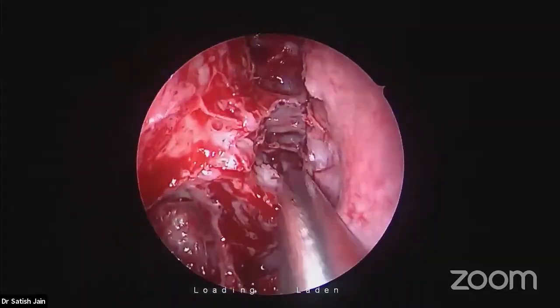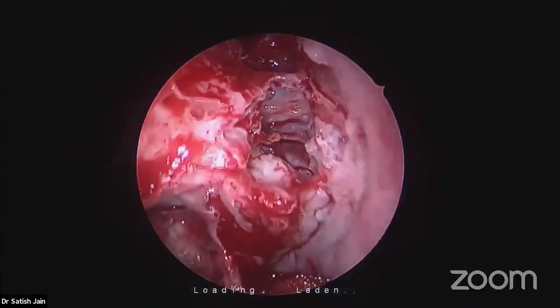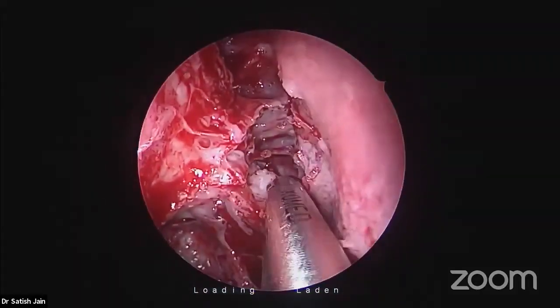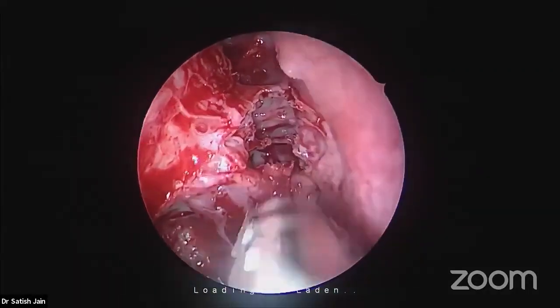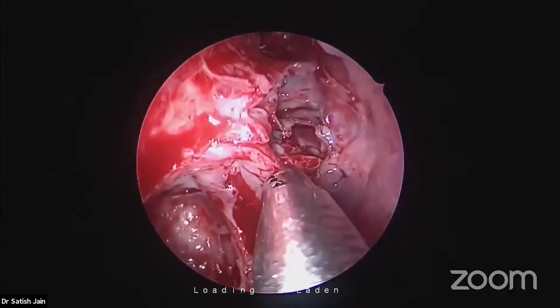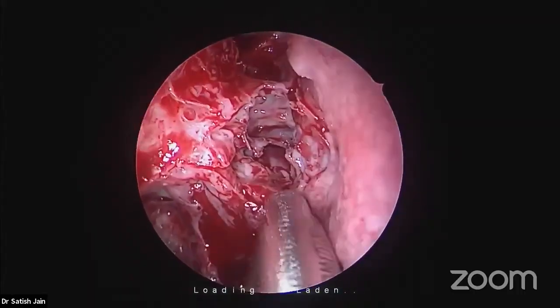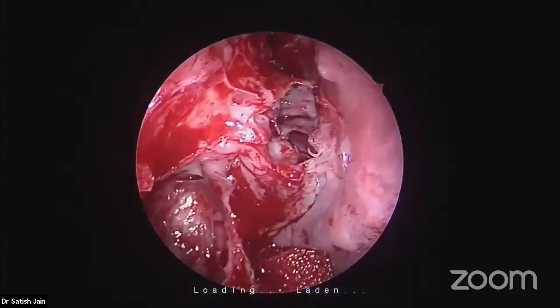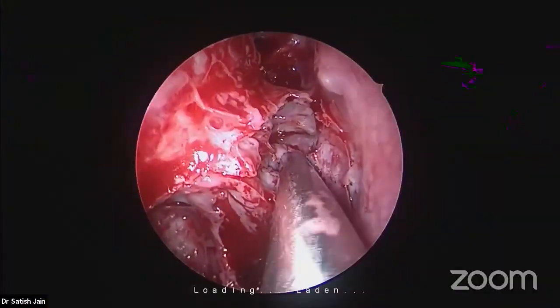So the first thing is to use the maxillary line and enter into the posterior ethmoid. Number two, I don't want to complete the posterior ethmoidectomy here because I don't know where posteriorly I might accidentally enter the sphenoid and damage the important structures there. So I have to be extra careful. I will not do the posterior ethmoidectomy here first. I will search for some landmark for the posterior limit of the posterior ethmoidectomy so that I don't enter into the sphenoid.